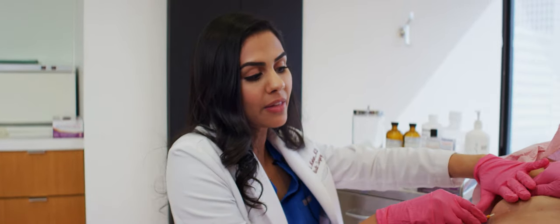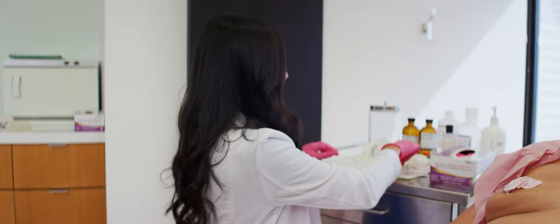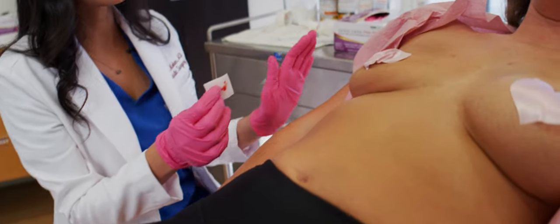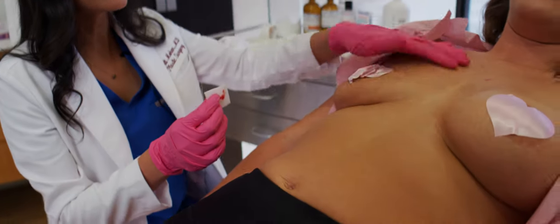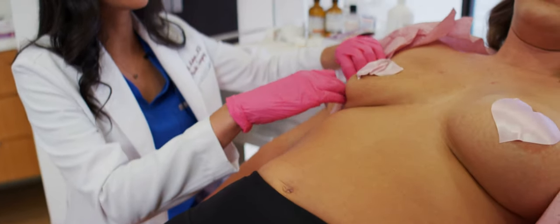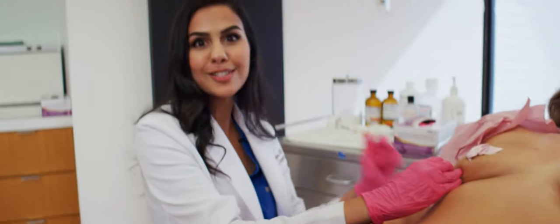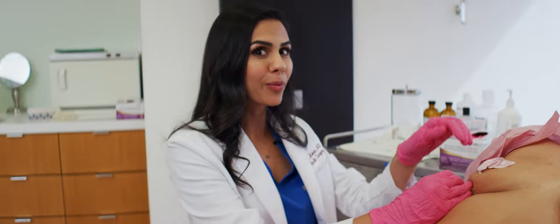It's totally safe to have that little saline bag in there for about four to six weeks, which is how long I recommend having deflation. And that's it — we are all finished and she did great. We're going to put a little bandaid on there, and you can see the immediate difference where this side doesn't have that saline implant compared to the other side. All the skin here is now going to shrink inward and upward, so when we put that new perky implant in, it's going to look so nice and natural with a lot of upper pole fullness.